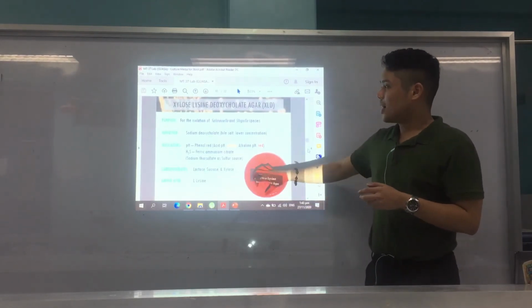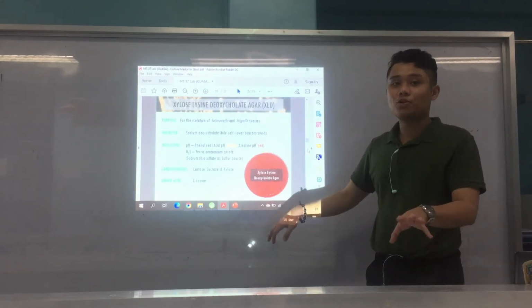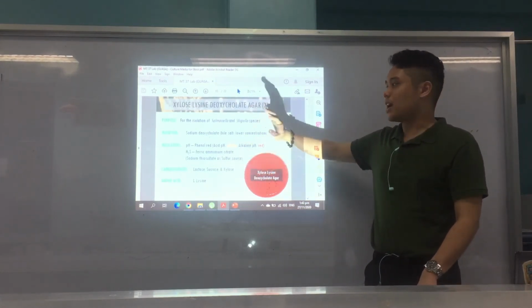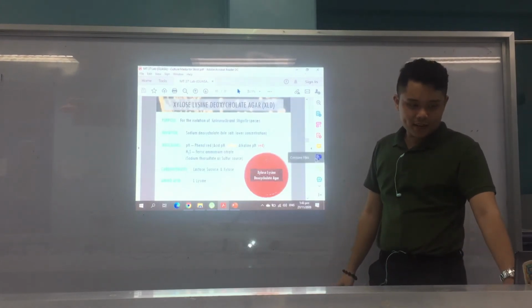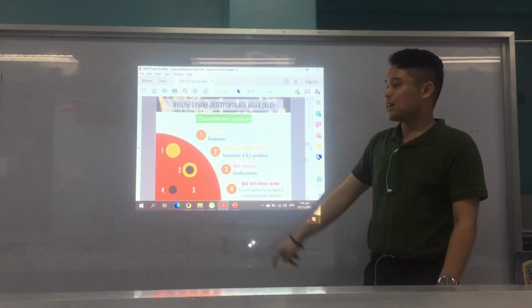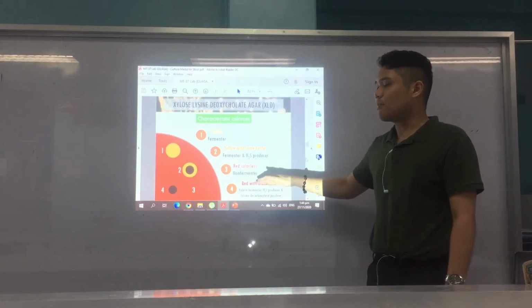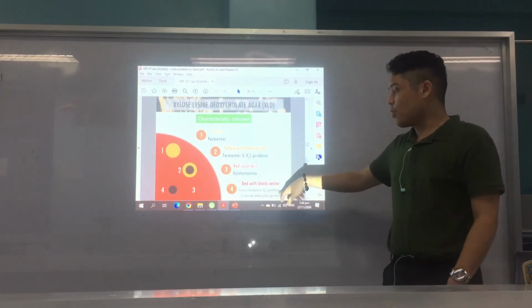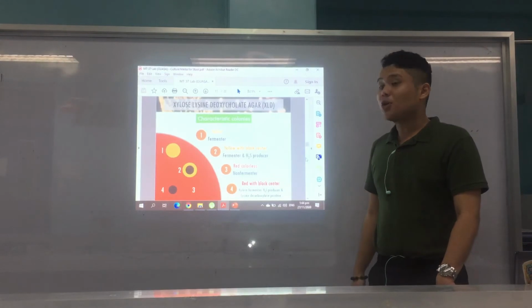So, again, actually, if I'm not mistaken, ang culture media of choice for Salmonella and Shigella? I'll have to check. It's either SSA or XLD, pero I think ang XLD to siya. Basta, again, familiarize lang din sa components, unsay mga characteristic colonies. So, for characteristic colonies, kung yellow, fermenter. Kung yellow with black center, fermenter and H2S producer. Kung red ra siya kay non-fermenter, pero wala may black, so dili siyang produce of H2S. And kung red with black center, xylose fermenter, H2S producer, and lysine decarboxylase positive.